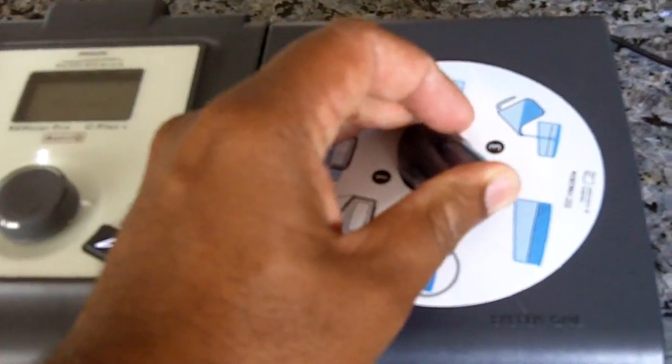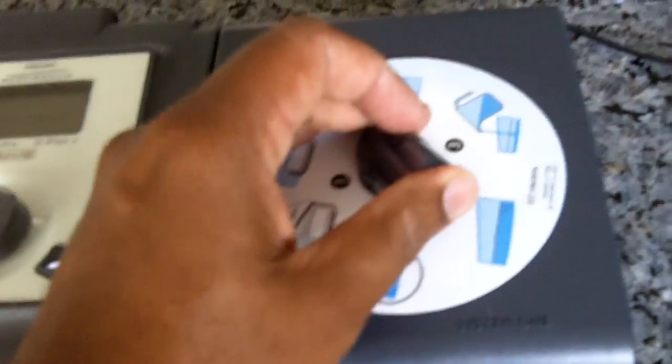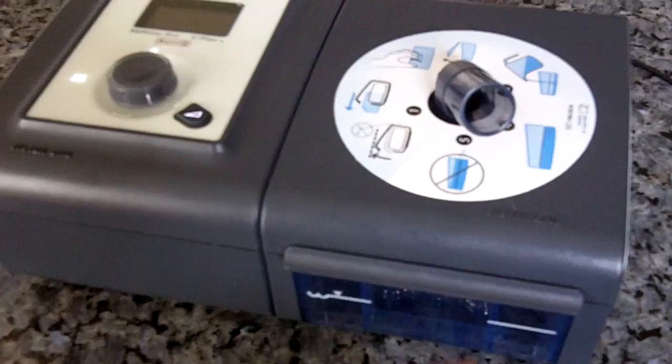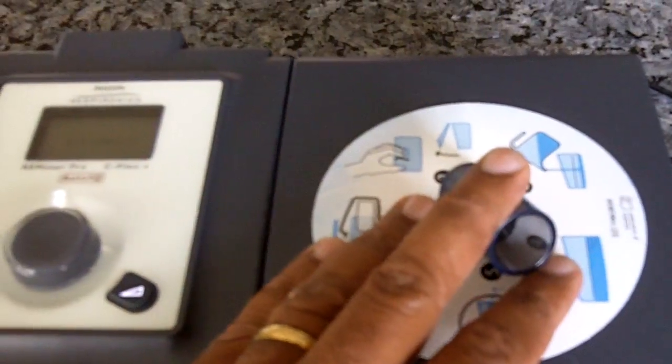What you have to do, if you want to see if it's working, is you turn it on. And see what I'm doing? I'm pretending that I'm creating a resistance, pretending there's a mask here. And that's when your heater will come on. That's the only way to check to see if the heater will come on.